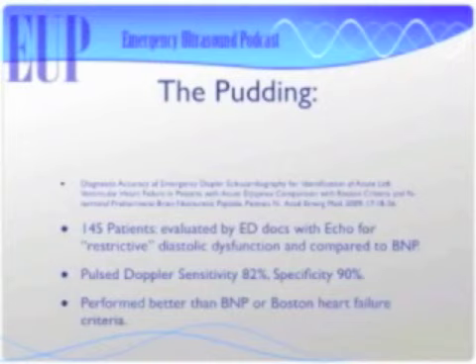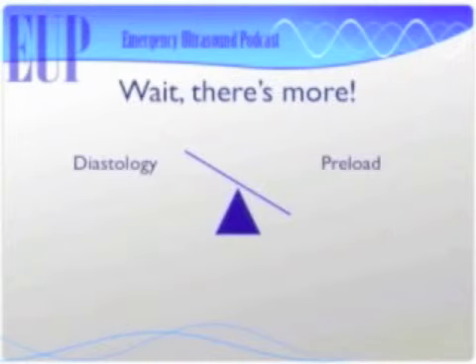That's not the only thing. Diastolic heart failure and acute heart failure exacerbations are not the only thing that you're going to use this for. I think once you get through this lecture, you'll hopefully appreciate that diastology really tells us a lot about preload. It tells us how much fluid is getting to the left side of the heart and how we need to treat those patients that are critically ill. So in patients in sepsis, diastolic function becomes important. And what you can actually do is use your diastology and your estimation of the diastolic dysfunction, and it can give you a number for your wedge pressure.